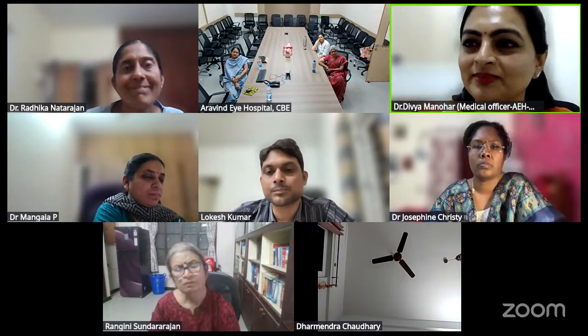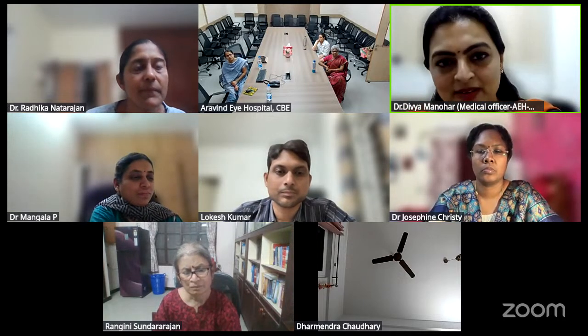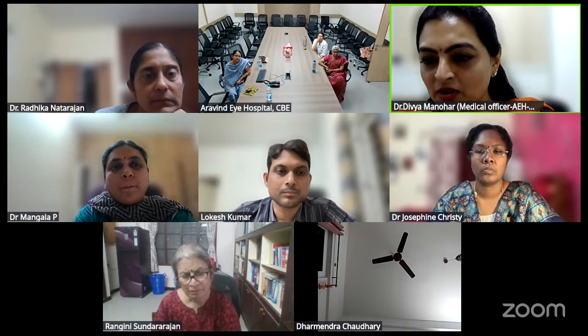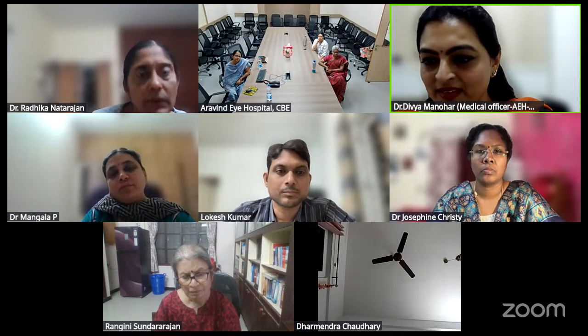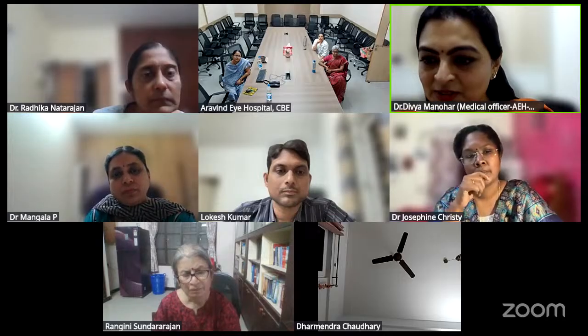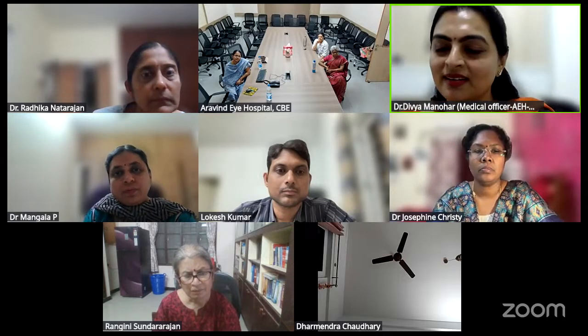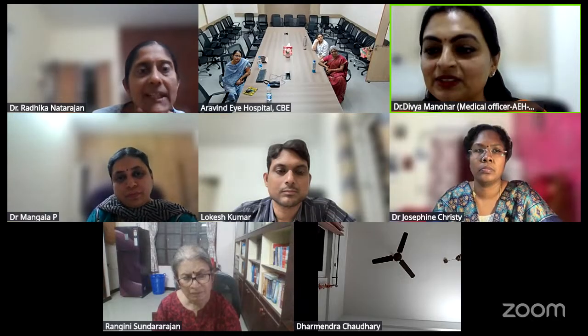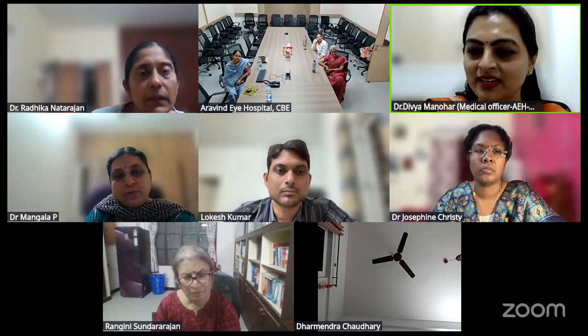Thank you, madam. Also, one point, if I may add, madam, for phakic IOLs, it's better to avoid it in patients who have used rigid contact lens for a long time. Right, because the aberrations are corrected with a rigid contact lens to a certain extent, and when you end up doing phakic IOLs in these patients, they might not see as clearly as what they would see with the lens. Excellent point.